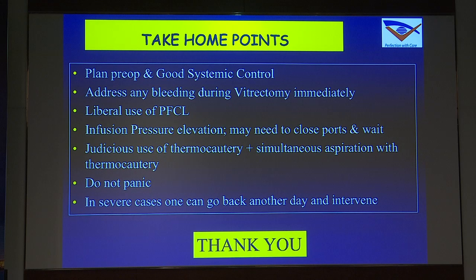Judicious use of thermocautery with simultaneous aspiration while you're doing the thermocautery. Therefore, using a chandelier in these cases is very useful. And in severe cases, you can always close up, go back another day, and intervene subsequently.